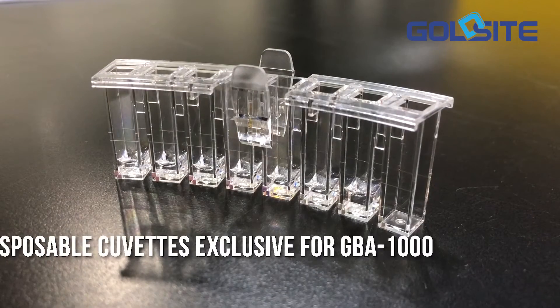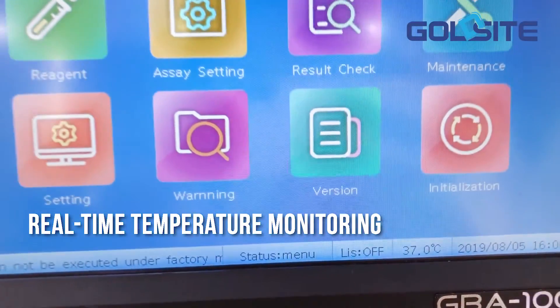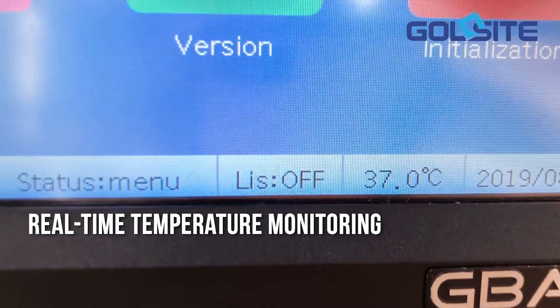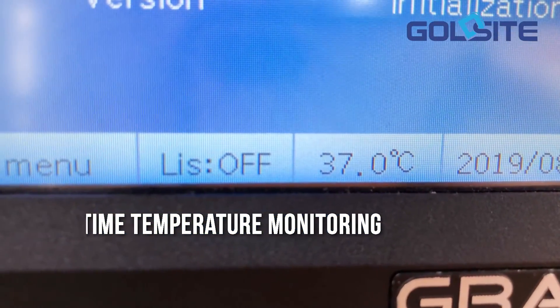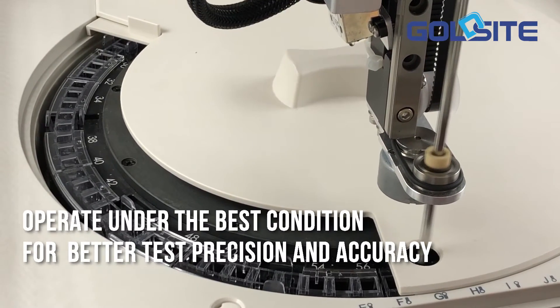Uses disposable cuvettes exclusive for the GBA-1000. Temperature real-time monitor updates the temperature onto the interface every second, making sure all tests operate under the best condition for better test precision and accuracy.